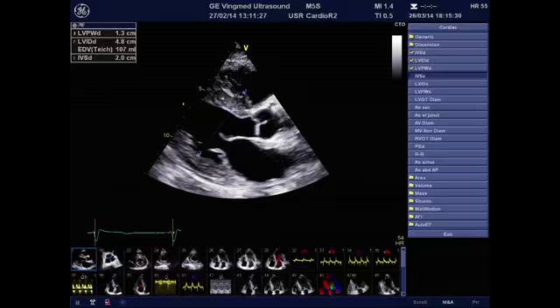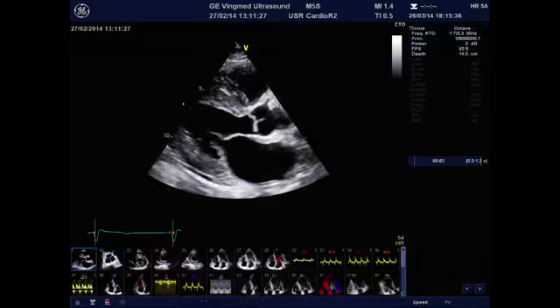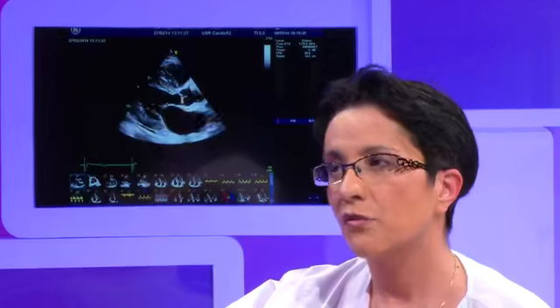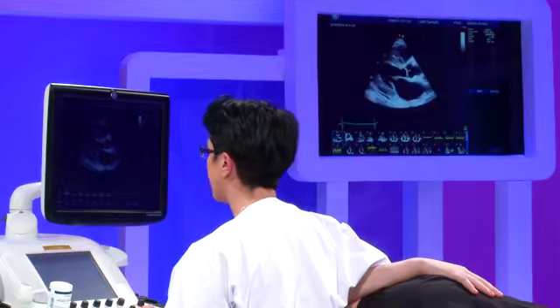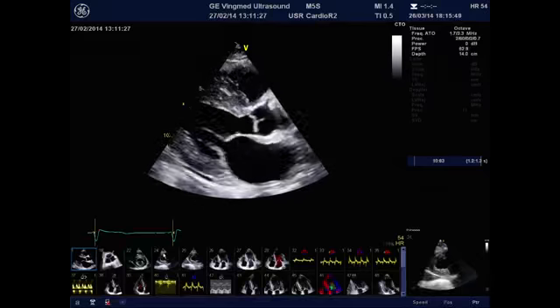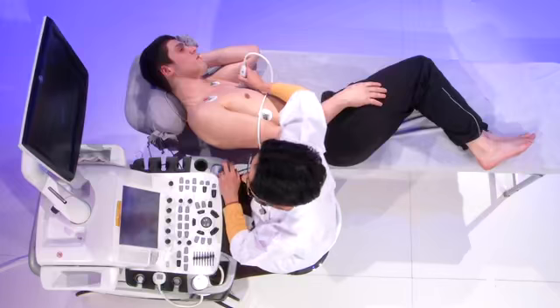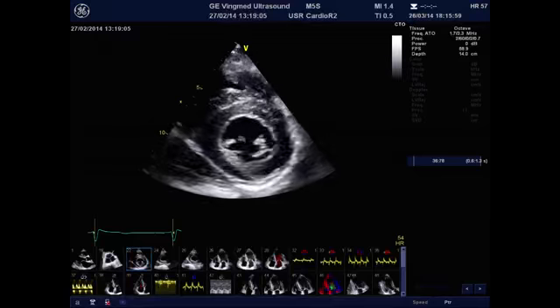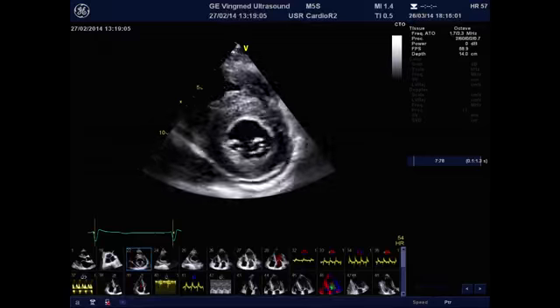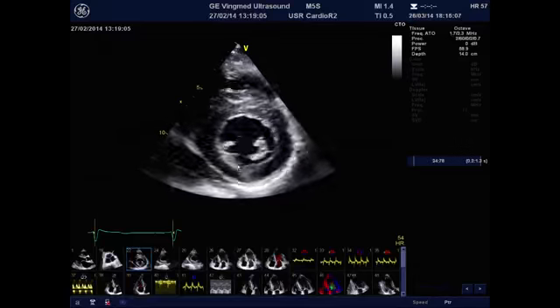wall from this side. You can also look at the fact that his interventricular septal structure is of a particular type. It is inhomogeneous and also quite sparkling. And when you change your image to a short axis view at the level of the papillary muscles just below the mitral valve, you can observe again that the hypertrophy involving mainly the interventricular septum is, however, of concentric type, and that the radial function of this ventricle looks preserved.